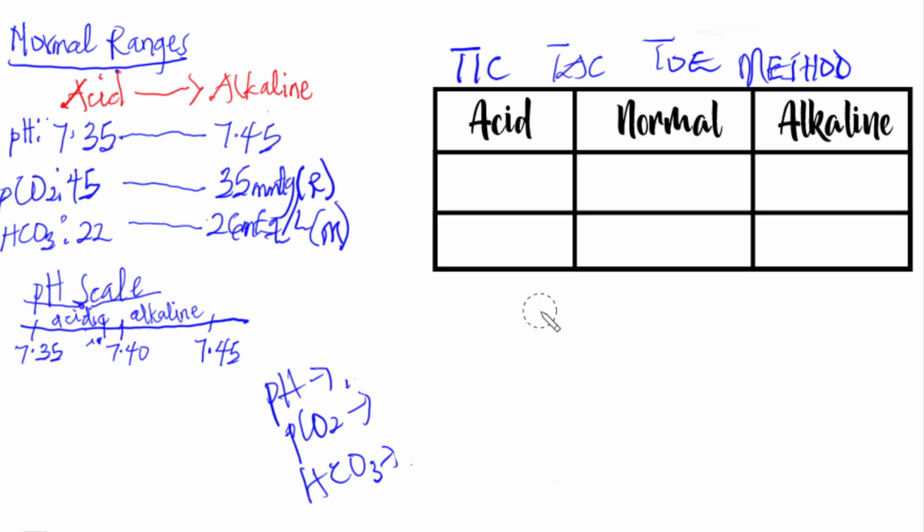56-year-old Mr. Kwesi Bentum came to your clinic this morning on account of progressively worsening dyspnea. He has a 7-year history of COPD and positive smoking and alcohol history, and so on and so forth. But at the end of it, you asked him to have an ABG test, and the results came, and the results were as follows. So his pH was 7.28. His PCO2 was 65, and HCO3 was 36.